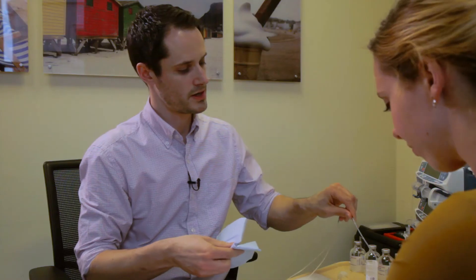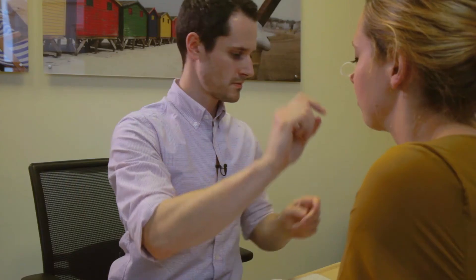What I'll do now is I'm going to put the catheter into one of your nostrils and then fix it in place with some tape. I'm just going to place this on your nostril first, and then I'll slowly advance the catheter along your nostril — it might tickle.